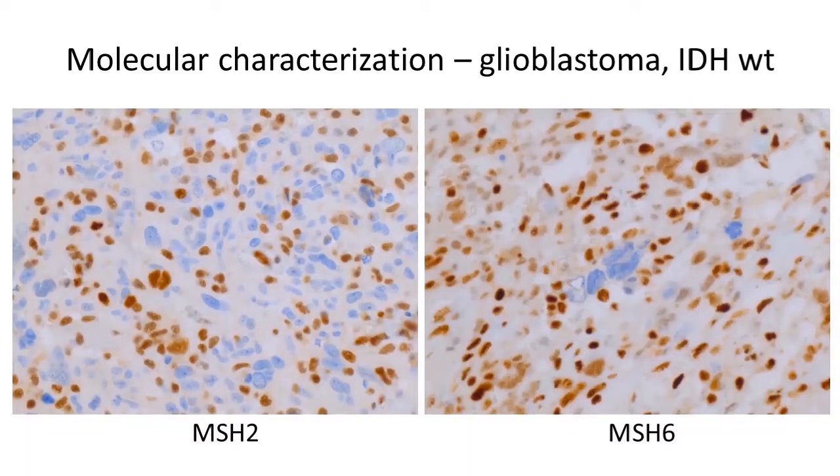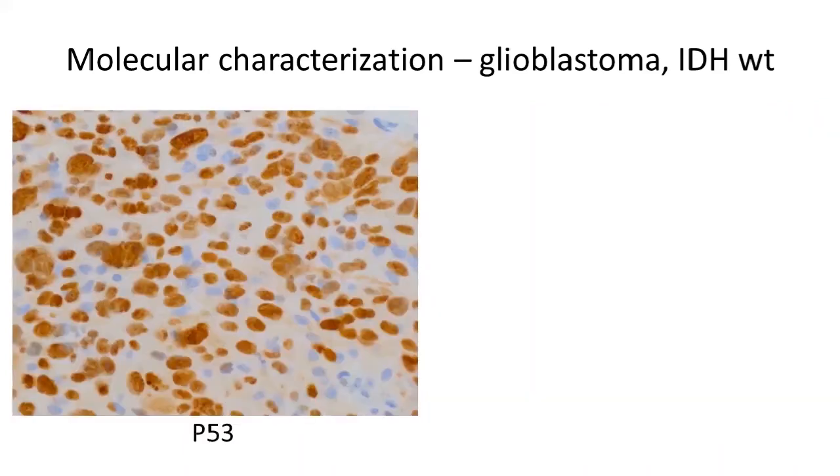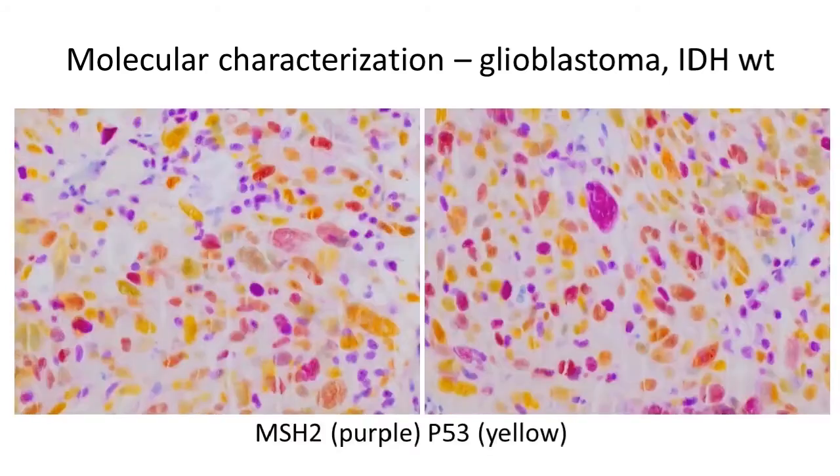So you could actually then in this tumor do staining, and this is the H&E slide, staining for these various MMR proteins, as you would also normally do, for instance, in colon carcinoma, if that's indicated, for instance, for MLH1 and PMS2, where you can see that in this tumor these were still present. But then doing the MSH2 stain and MSH6 stain, you can see that some of the cells do not stain.